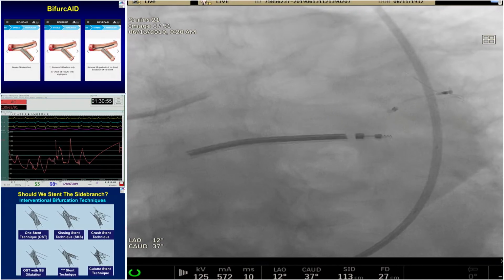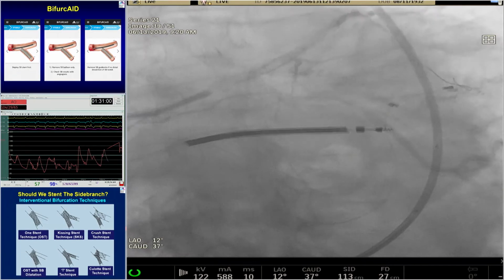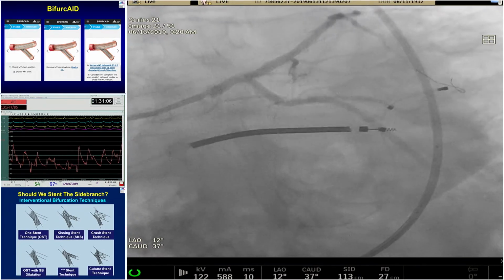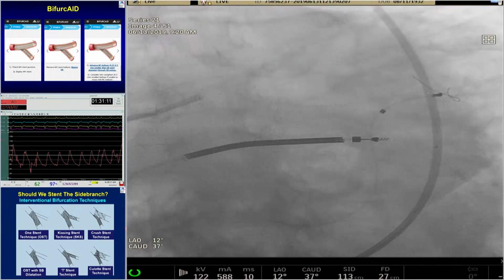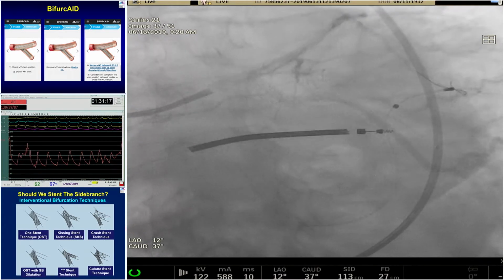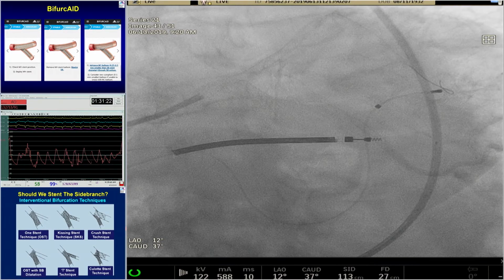That distal edge of the stent and just the outflow, it looks a little, yeah, that's the way they will look. Yeah, we're not going to touch it. You know, Roxana, if Dr. Colombo, we looked, we still did not publish. We needed to publish. When you do 2 stents in the left main, culotte, DK crush, whatever technique, provisional, and then crossover, the restenosis rate, if you do late follow-up up to 3 years, is more than 50%. If you don't have restenosis at 1 year, you wait, it will come at 2 or 3 years.